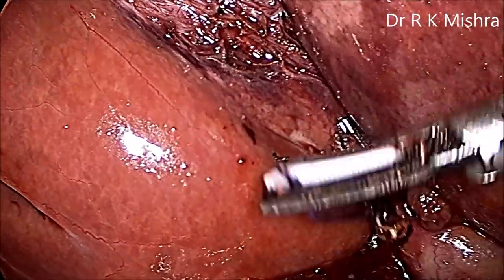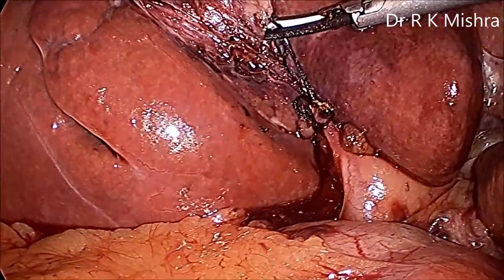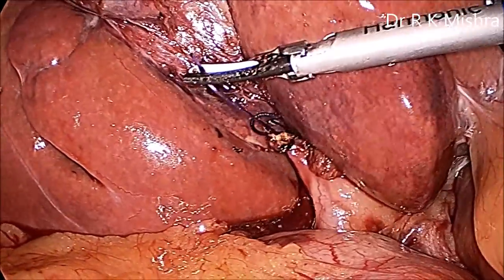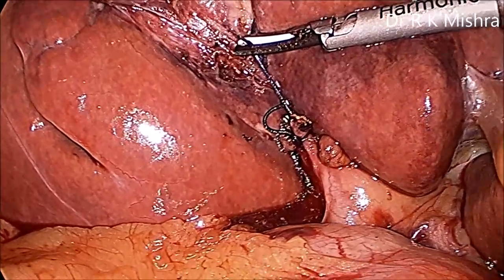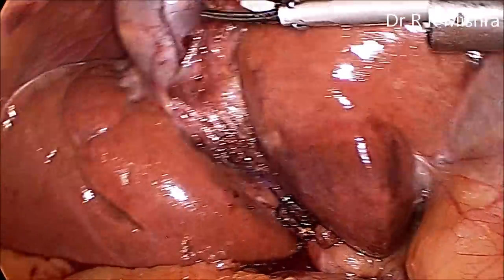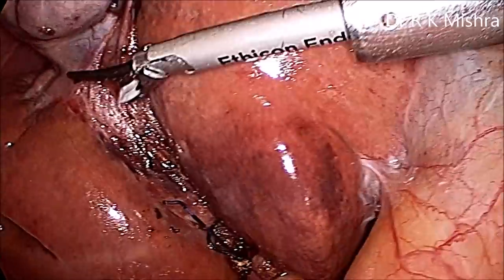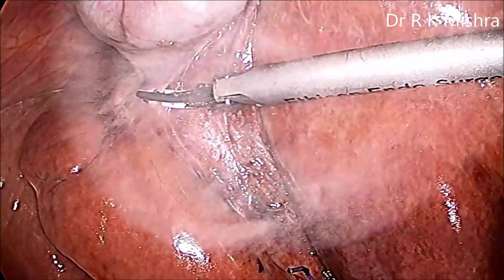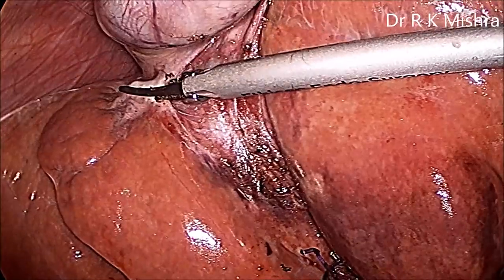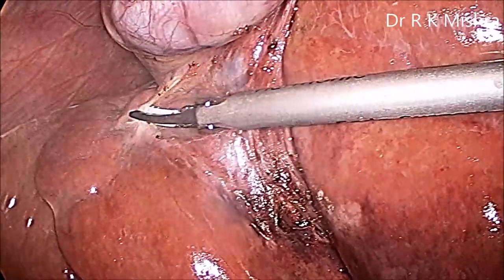Now the rest of the gallbladder can be separated easily. You can see the power of Misra's knot — we are not applying a lot of force but it is not slipping; if you pull it, it becomes more tight. This is the dumbbell effect — fantastic. Now separate the rest of the gallbladder. Once half of the gallbladder is separated, ideally you should keep the light cable down so it gives very good vision between the gallbladder and liver, providing a good angular plane.